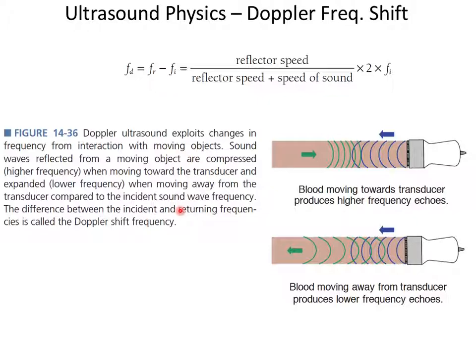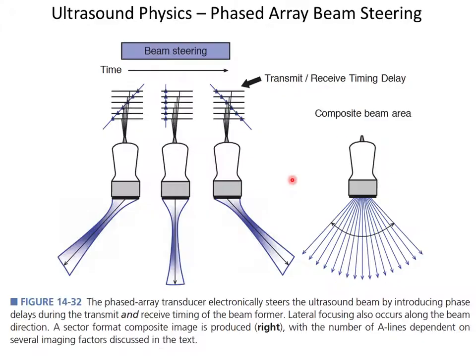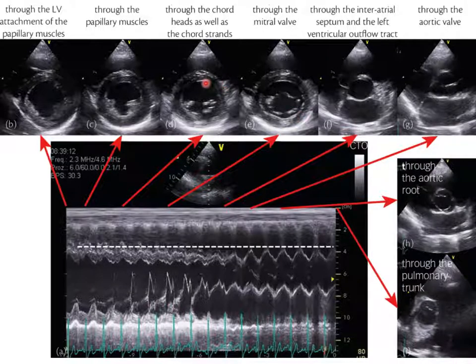That's pretty powerful, right? Because a lot of stuff's moving around, you would like to know how fast it's moving. And interestingly, even though when you make images, you kind of ignore the blood signal, as we saw here, this is blood in here.